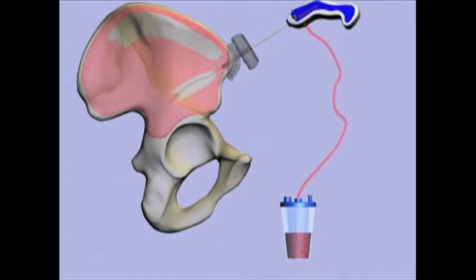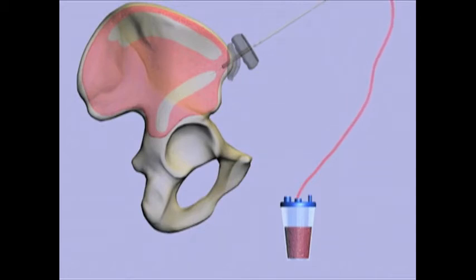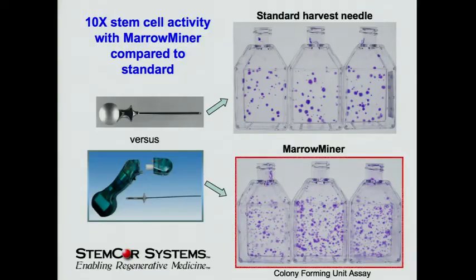So we did a few prototypes, got a small little grant at Stanford, and played around with this a little bit. And our team there has developed this technology. And eventually we got to large animals and pig studies, and we found, to our surprise, that not only got bone marrow out, but we got 10 times the stem cell activity in the marrow from the MarrowMiner compared to the normal device. This device was just FDA approved in the last year.